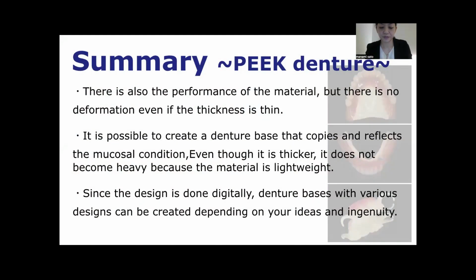Summary of PEEK dentures. I feel that by combining the performance of PEEK with digital technology, we can expect a variety of possibilities for the future.